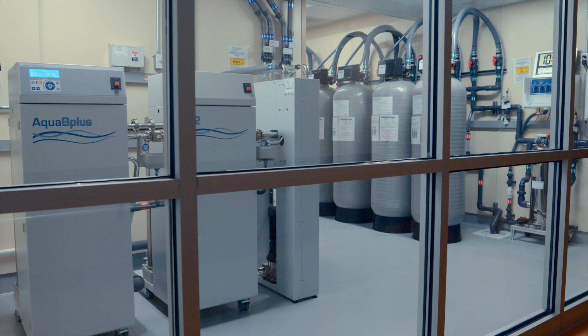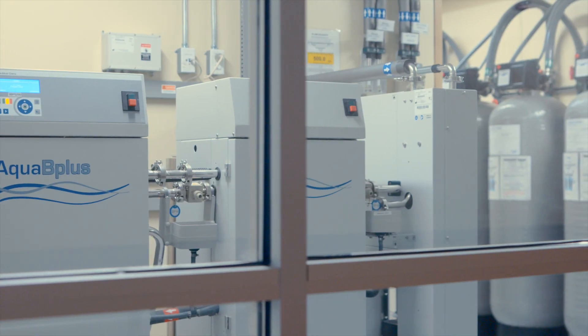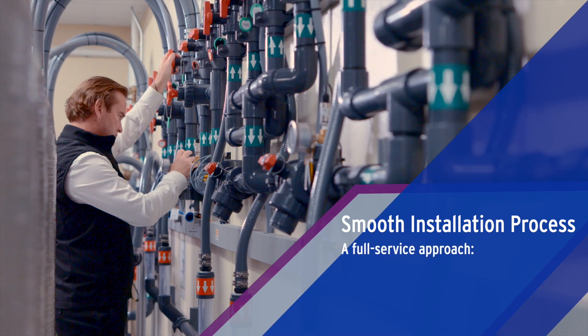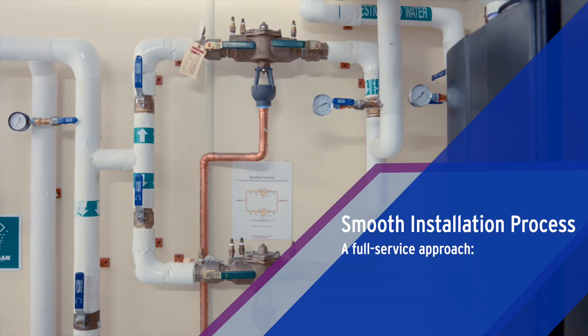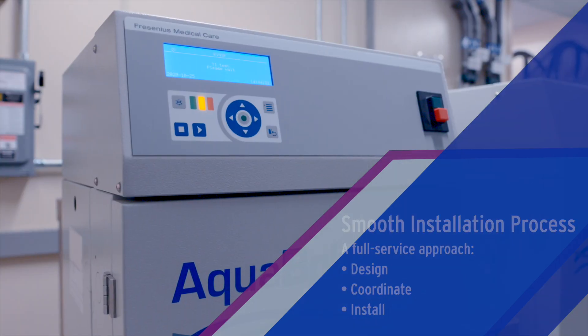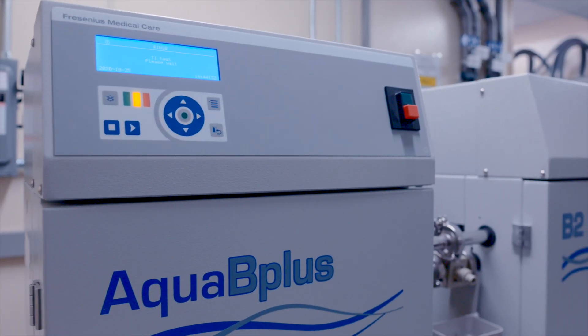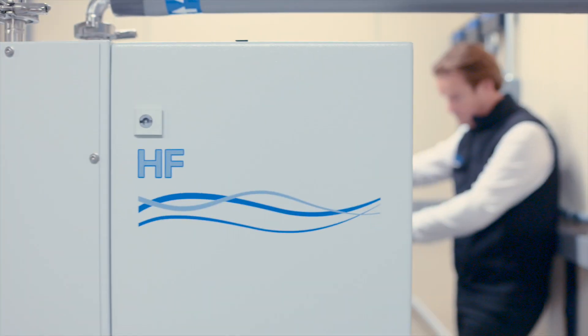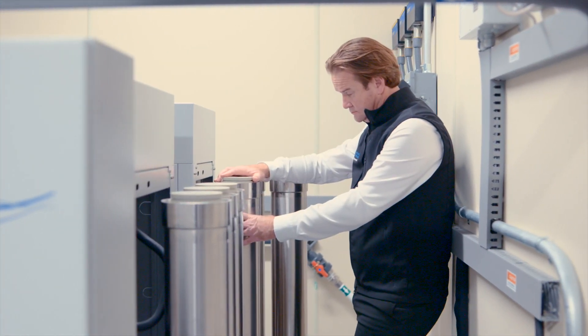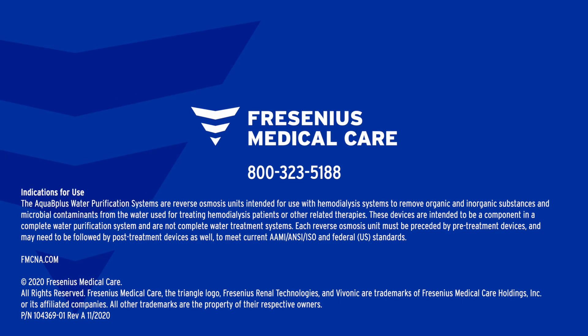This sums up our fully installed dialysis water treatment system. A dedicated installation engineer will manage your implementation through a phased approach including design, coordination, and installation. Once we've designed a system for your clinic, you can expect a smooth installment, all managed by a full service team. Ready to learn more about the Aqua B Plus RO system? Please contact your local Fresenius Renal Technologies sales representative.